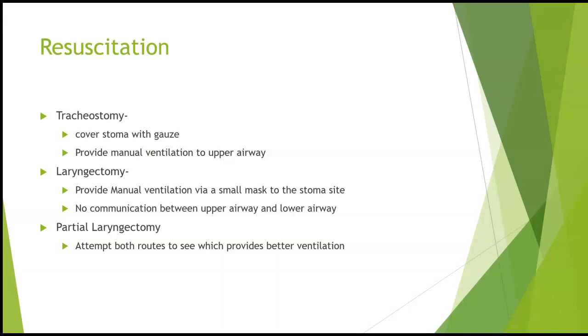So obviously, if it's an endotracheal tube that comes out, we're just going to put one of those oral nasal facial masks on the patient and use a manual resuscitator over the patient's nose and mouth and bag the patient. Okay, that's what we've practiced in lab a lot. If the patient has a tracheostomy tube, you're going to want to cover the stoma with gauze.